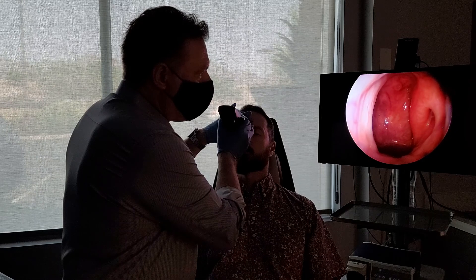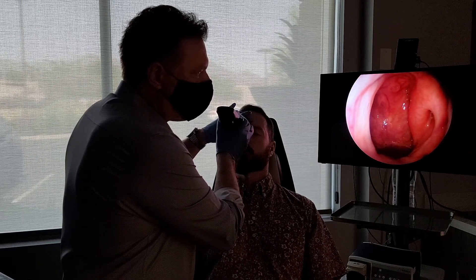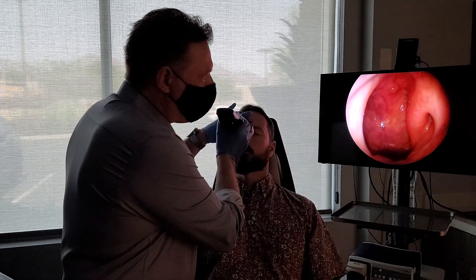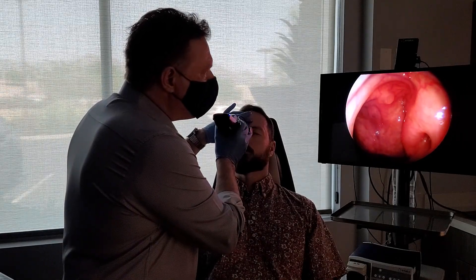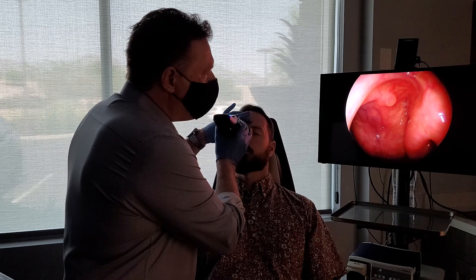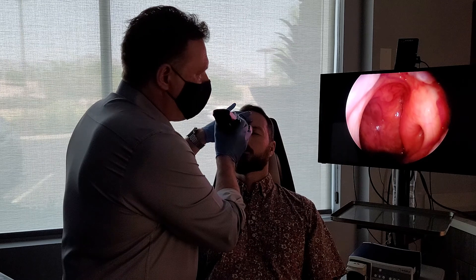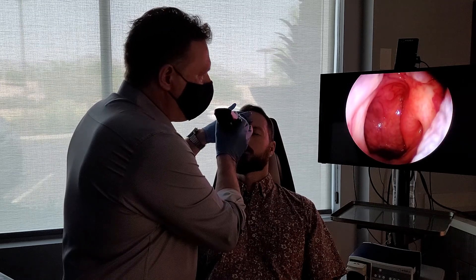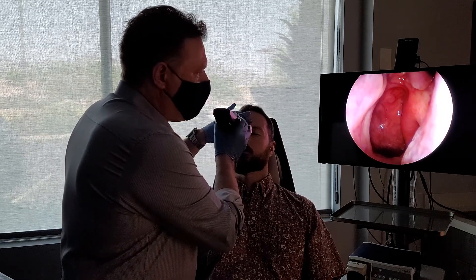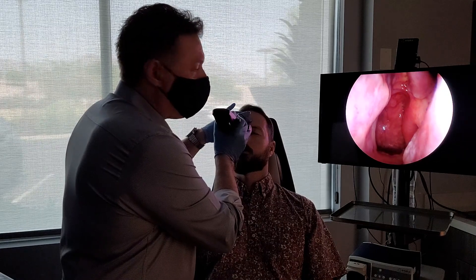At three o'clock is the opening for the eustachian tube, called the torus tubaris. Looks like there's a little mucus coming out of there in the back. Kevin even has a little cyst up here right in front of us up top — that's not a cyst to worry about, that's where the adenoid tissue would live. Now if we follow this all the way down along the bottom at the six o'clock mark, we would be going into the oral pharynx to view the vocal cords.